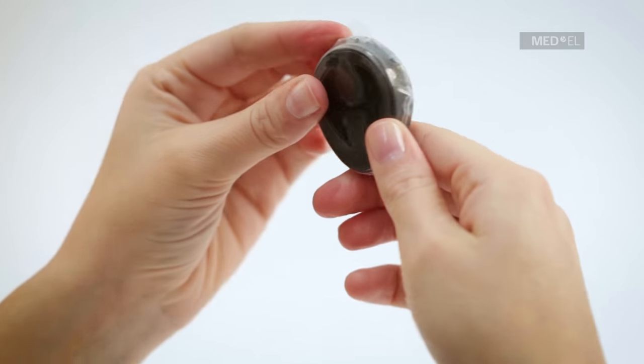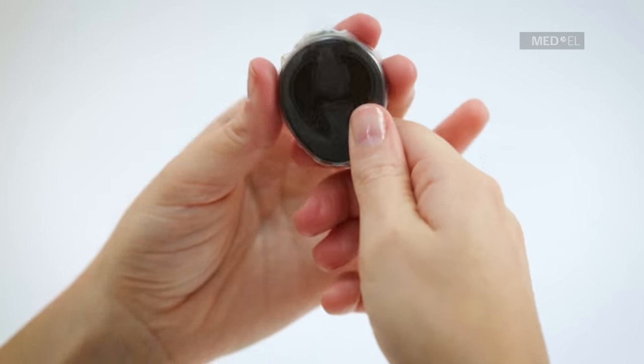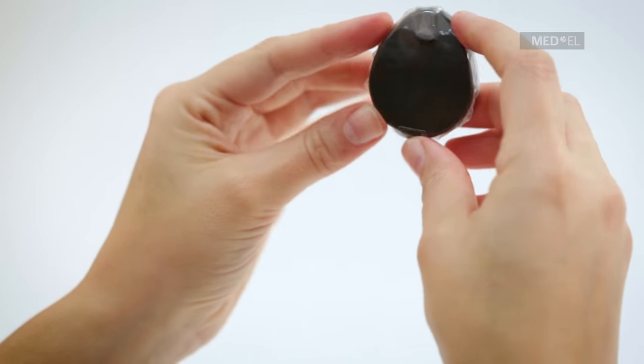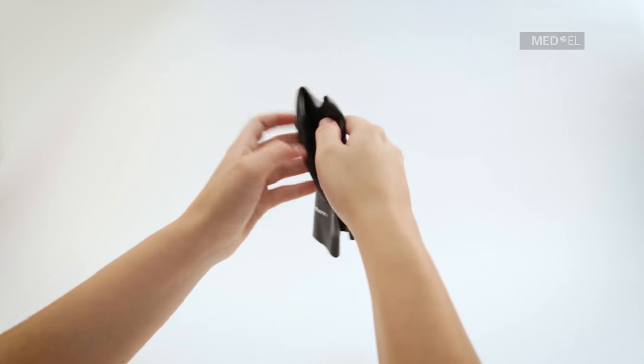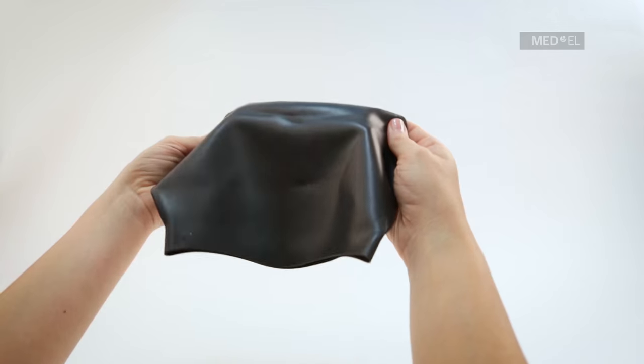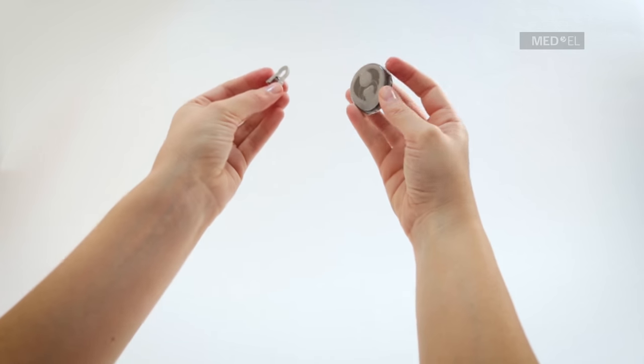Your Rondo with waterware is now ready to use. Position Rondo with waterware over the implant. To avoid losing the processor during activities, you should use additional fixation, such as the Med-El Sports headband, a swimming cap, or the attachment clip.